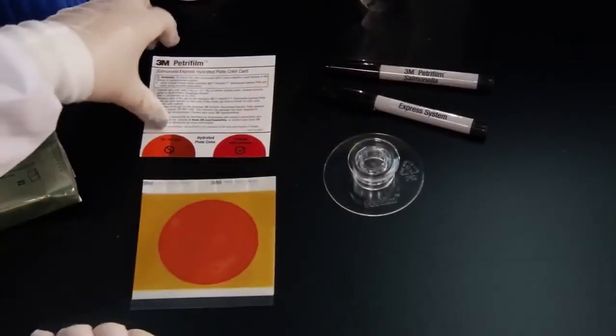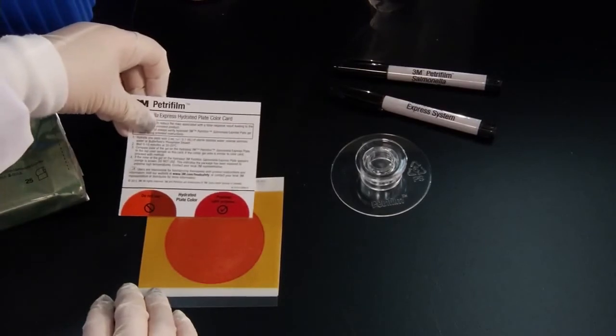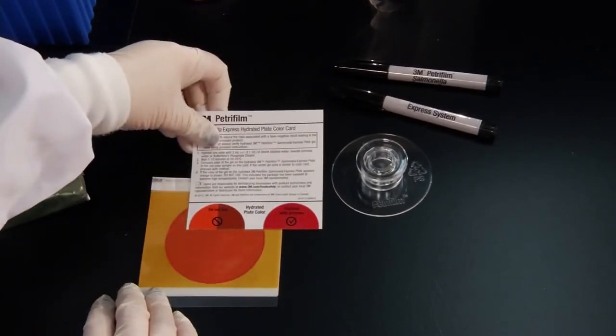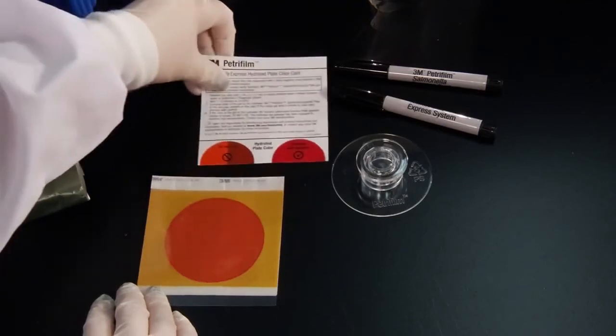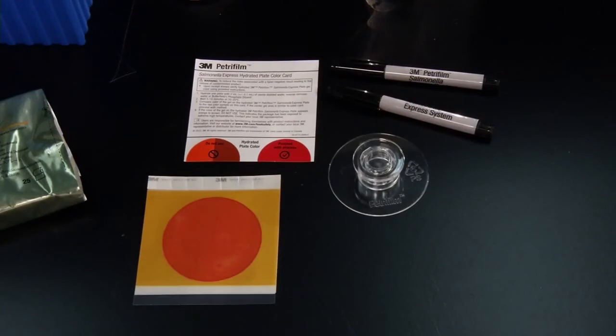After a few minutes, check the hydrated plate gel color using the 3M Petrifilm Salmonella Express Hydrated Plate Color Card. If the gel color is red, the plates are good to use. If the gel color is orange to brown, the plates have been exposed to extreme high temperatures and product performance may be impacted. Do not use the plates, and contact your local 3M food safety representative.